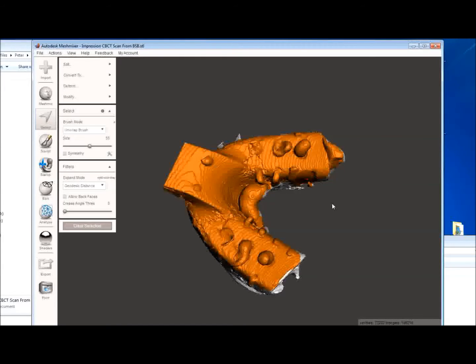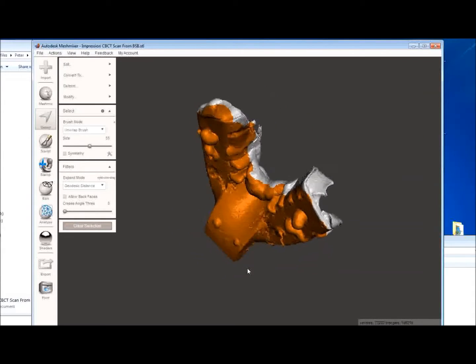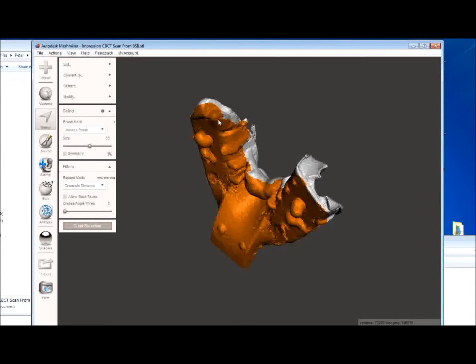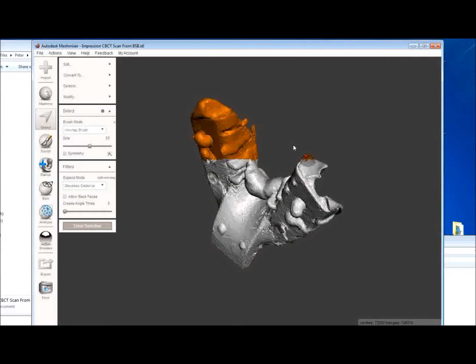And again, try not to, we can rotate the image to get a better view. Try not to go over the edge and into the vestibule area. Go ahead and just paint this away.